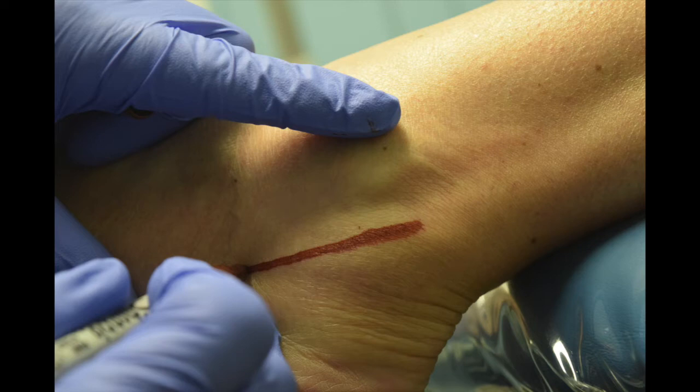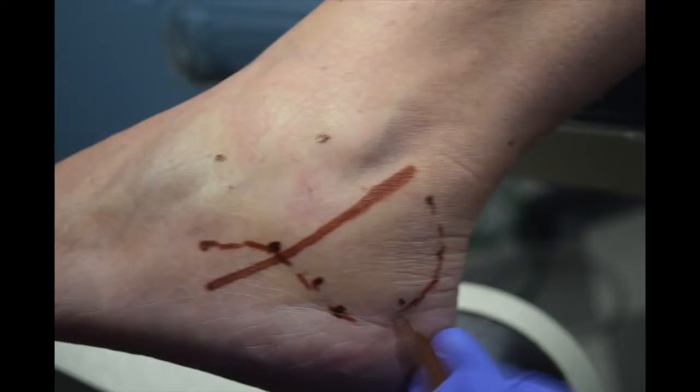We map out the sural nerve so we don't injure it. As you know from anatomy, about a finger's breadth away from the fibula is where the sural nerve is going to course through, so we mark that out. Then the second thing we do before the surgery is take our C-arm and use a small curette to give my markings of where the heel is at — I put a little dot there and we draw the heel out in its totality.